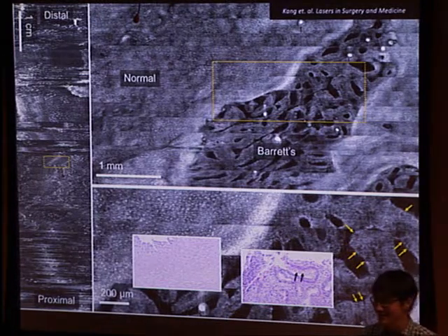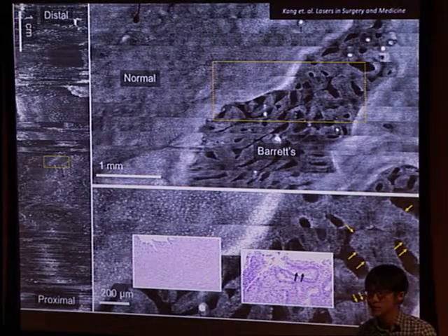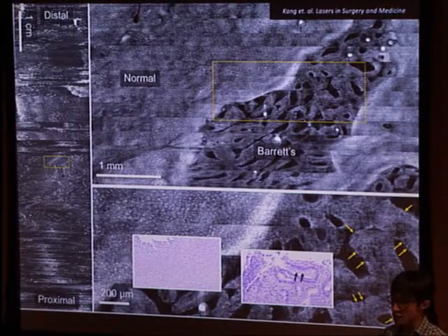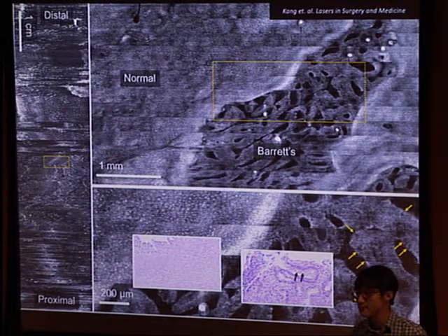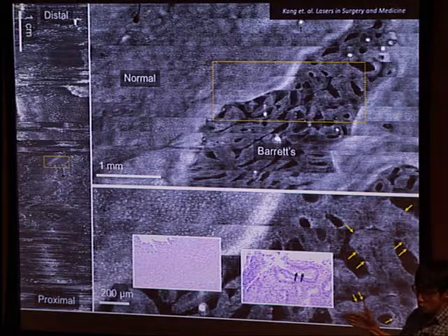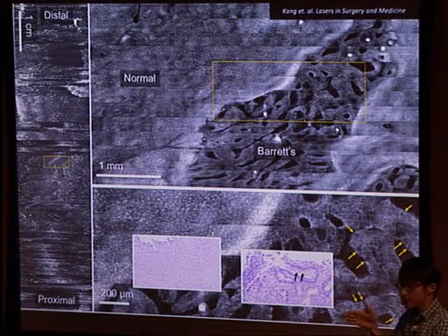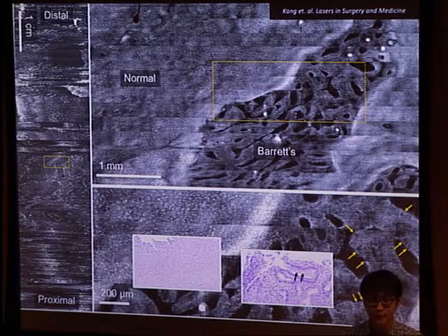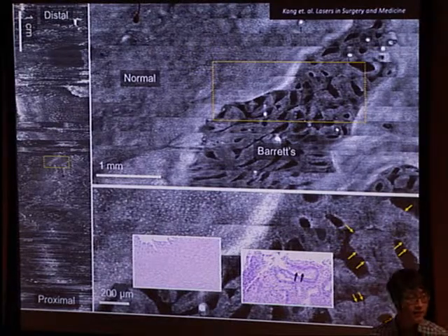Sorry, I was going to miss that. Sure. So that is a field of view this way, 280 micron. What is the field of view the other way? That's based on the rotation of the device, which is 22 millimeters. One shot will give you only one line, and then you reconstruct. Basically, the device is rotated this way, so the width of the image that it can cover by one rotation is about 22 millimeters. So it's conventional confocal in that dimension, and in the other one you've got these 280 micron strips.